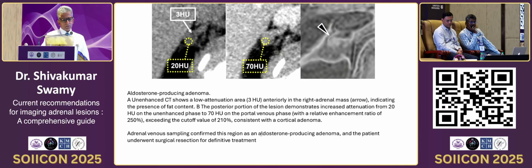This is an example just to show this particular adenoma. The anterior part has a very low HU, which is 3. Definitely you know that this is fat, but in the posterior part the attenuation value is higher, definitely more than 10. This is an intermediate or indeterminate lesion.